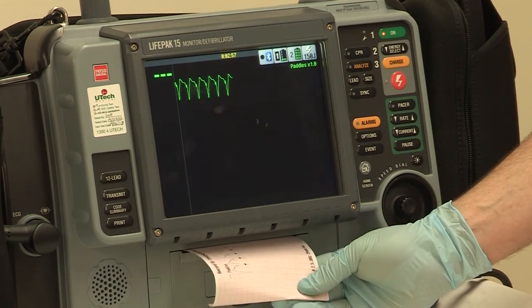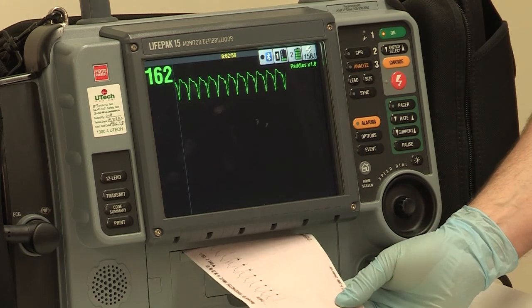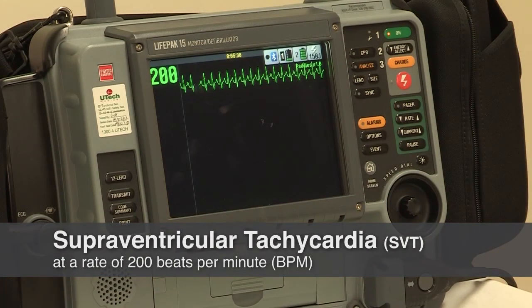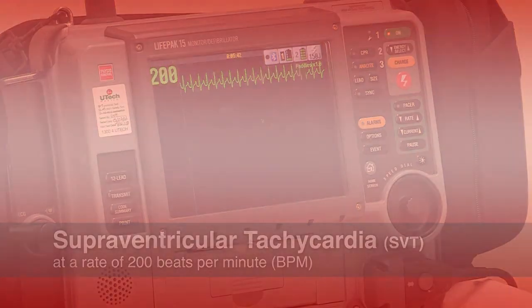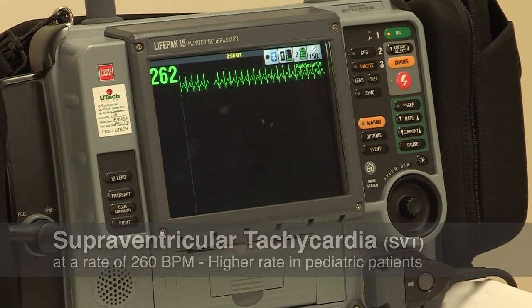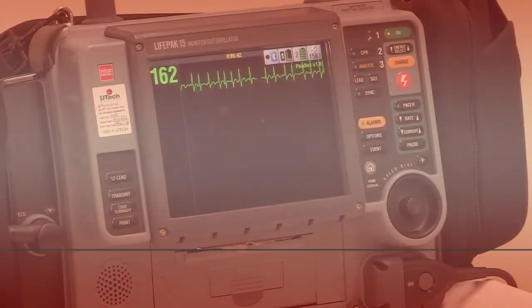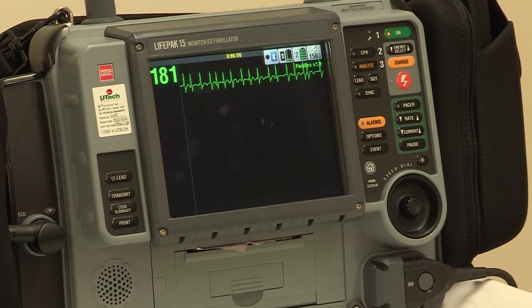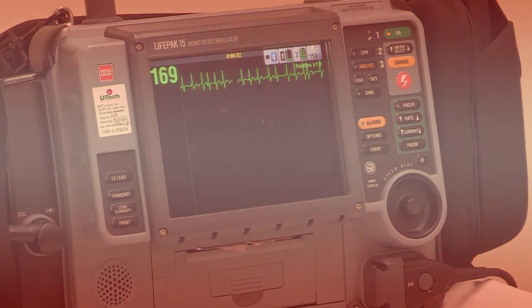Here we've been talking about VT only, but we will show you on the screen the other rhythms that you may encounter. Here is an SVT or supraventricular tachycardia. Here is a supraventricular tachycardia, which you might see in a paediatric patient. And here is atrial fibrillation. These are all rhythms that could possibly be treated with synchronised cardioversion, remembering that this is only in the case of unstable and severely compromised patients.